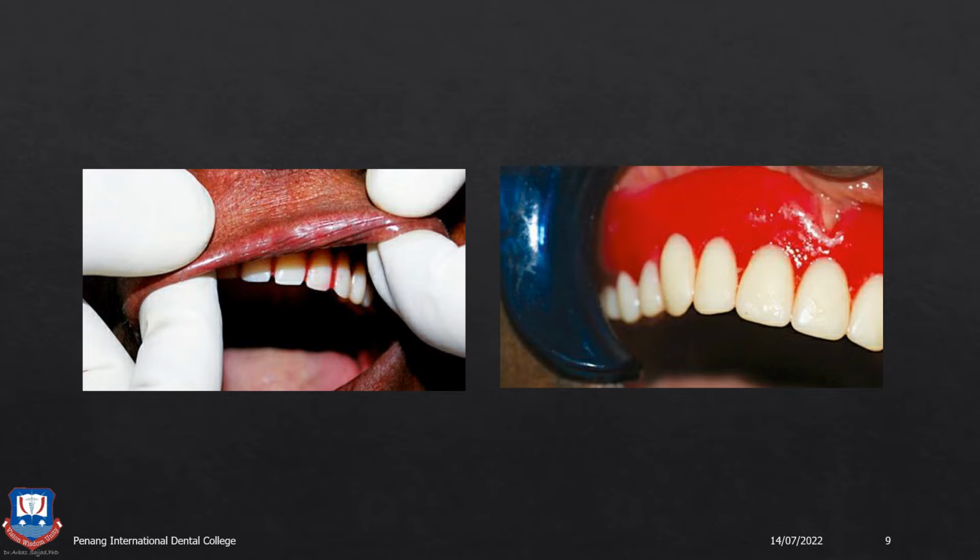Next, we insert the upper denture. We similarly check the upper denture for the peripheral border seal. You should be able to see the mucobuccal reflection. That is, the mucosal fold or the mucosal reflection from the vestibule should be visible. It should not be that the denture is pushing against the vestibule or the sulcus and you are not able to see the movable and the attached gingiva. So the mucobuccal fold has to be visible just above the denture border.